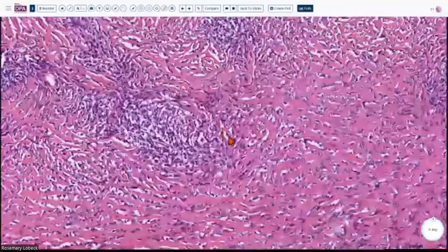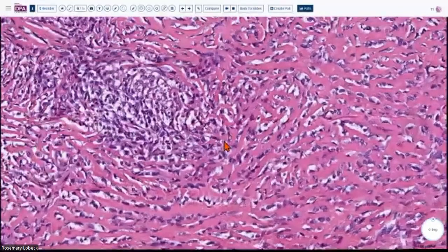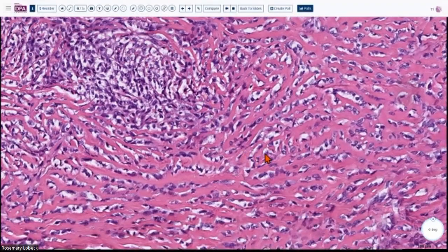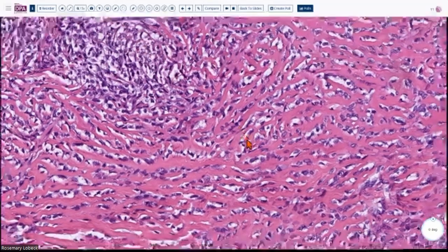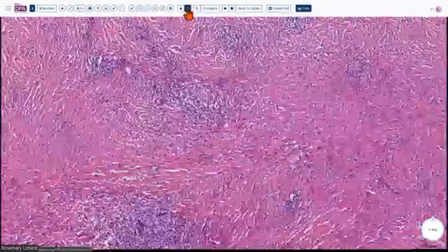So you can see that the nuclei, unlike the LGFMS that we saw earlier, are very rounded, right? They're small, but they're rounded. But look at the fibrotic stroma over here, right? This is almost like what is called an Indian filing pattern in lobular carcinoma of the breast, or plasmacytoid urothelial carcinoma, or diffuse carcinoma of the stomach. And this, if you do EMA, is going to be strongly positive. So this is another huge pitfall in these tumors. One has to recognize that this pattern is possible in low-grade fibromyxoid sarcomas.